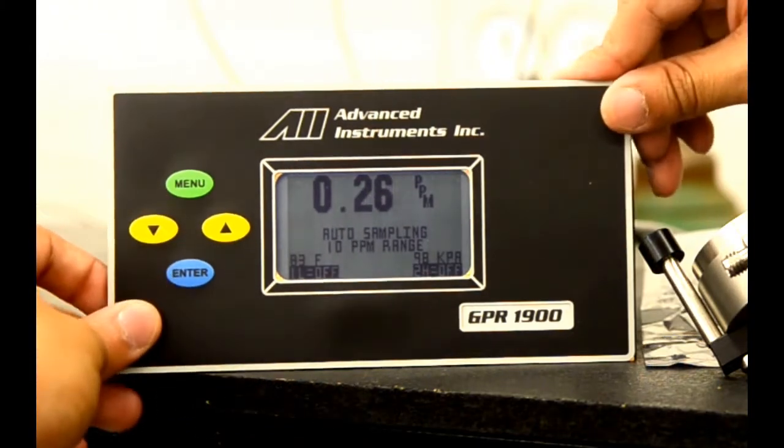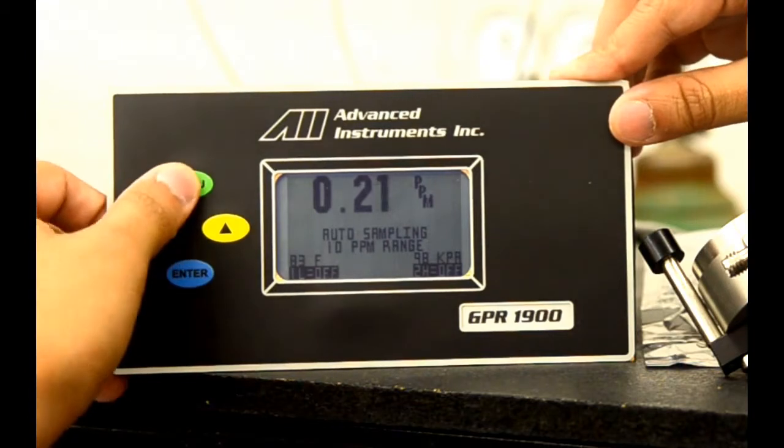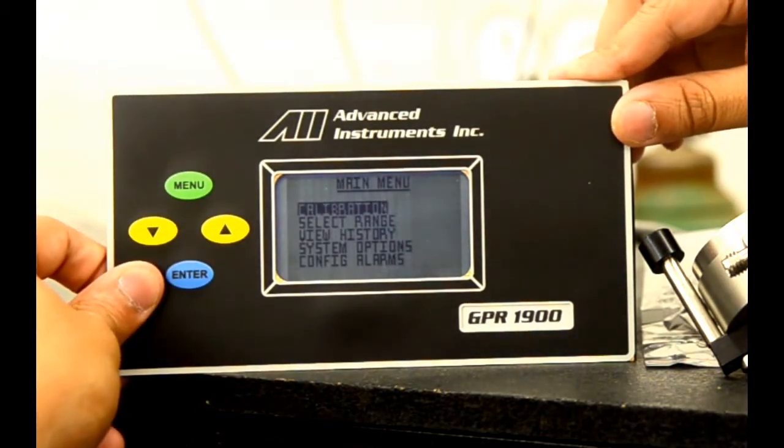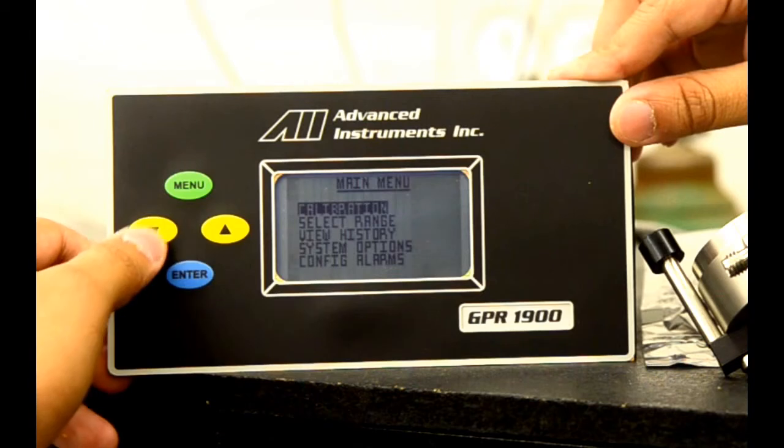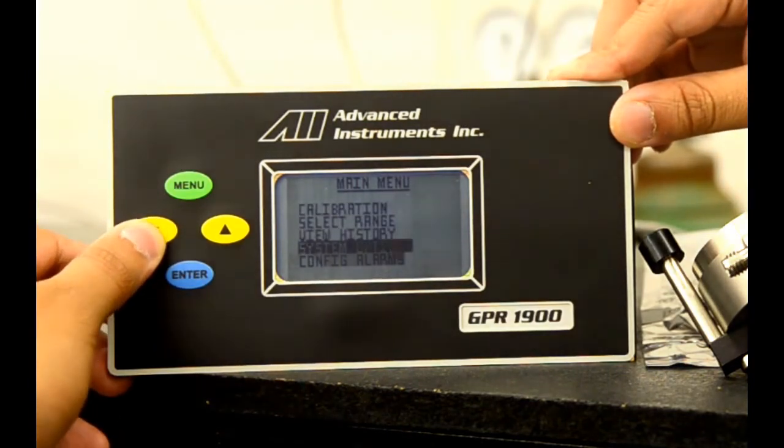The main screen also shows the alarm values as well. From here, you can hit the menu button and be taken to the main menu. There you'll have the options of calibration, select range, view history, system options, and configure alarms.